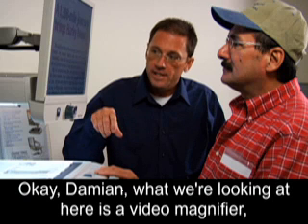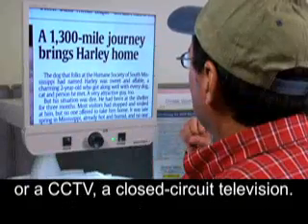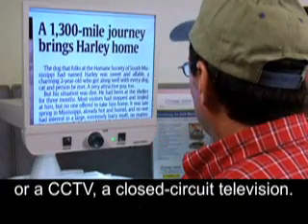Using technology to stay connected. Two men facing a screen displaying a newspaper. What we're looking at here is a video magnifier, or a CCTV — a closed circuit television.